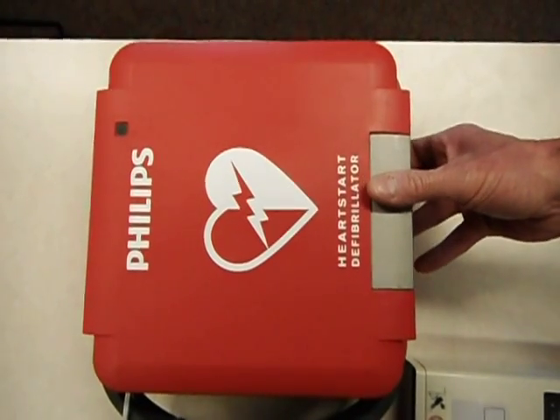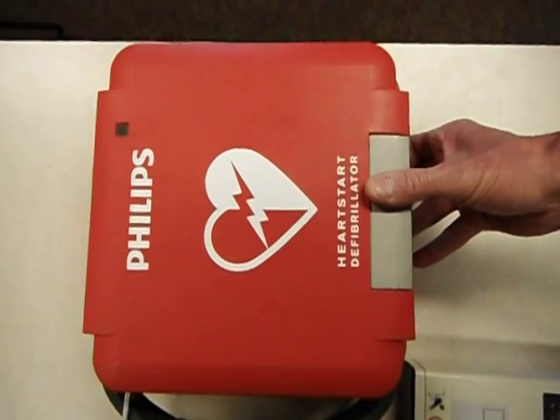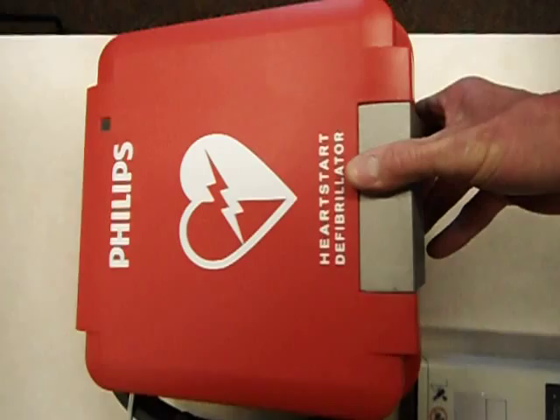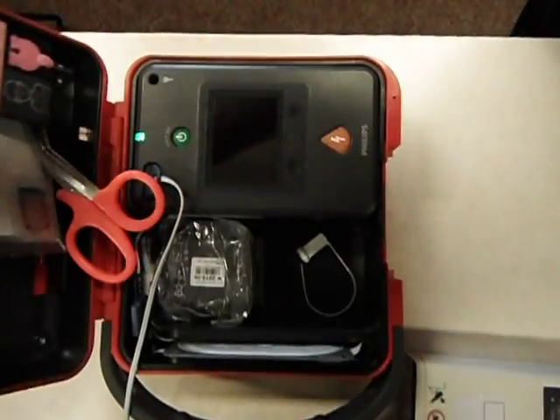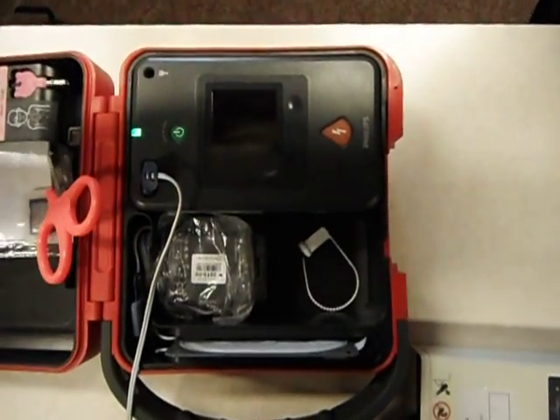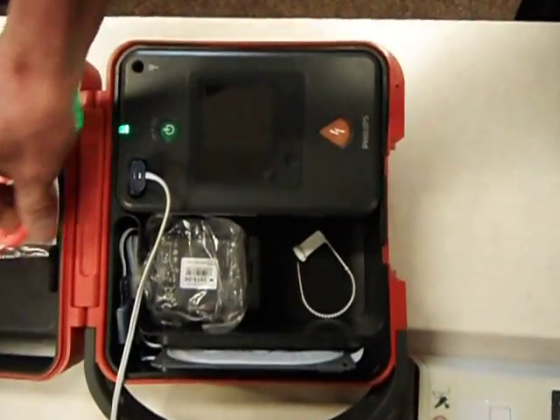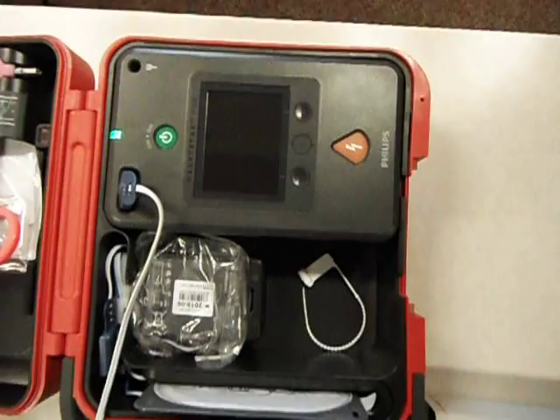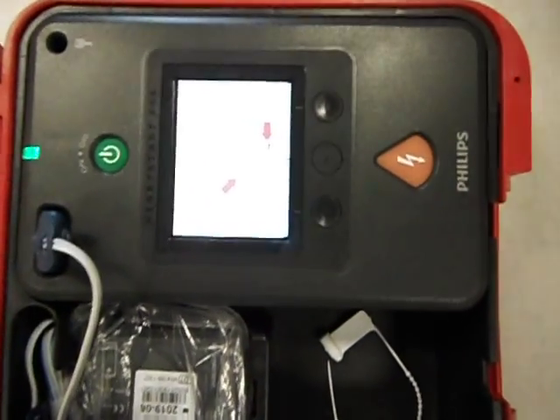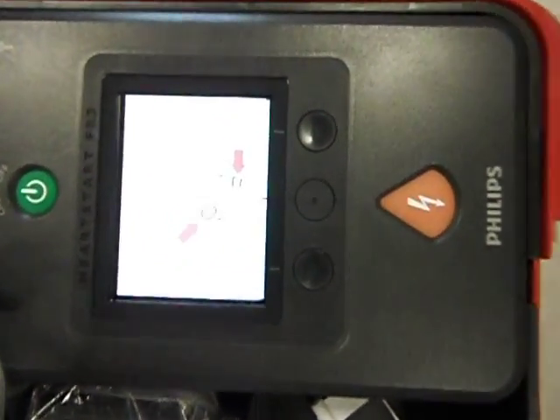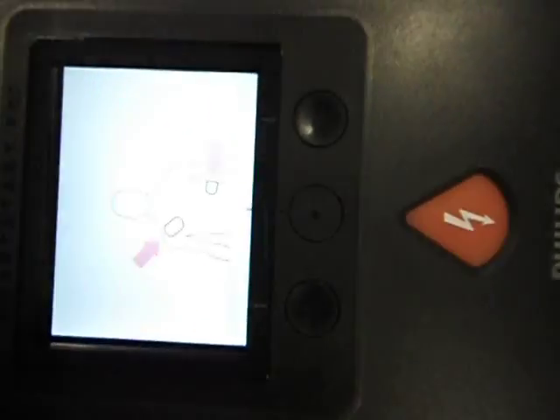We're here today to demonstrate putting the FR3 into manual mode. Again, it turns on when you open the lid.